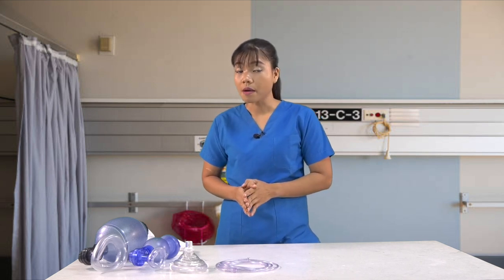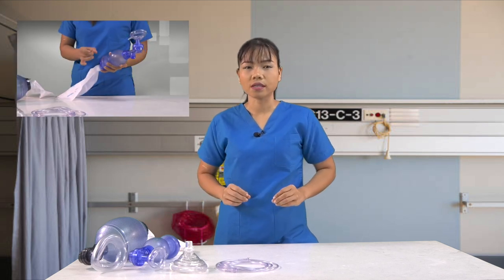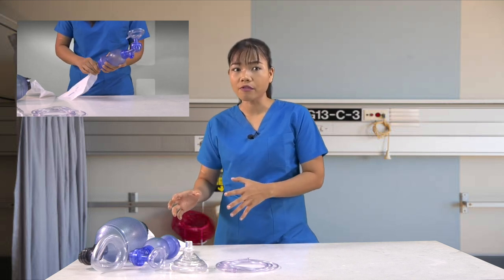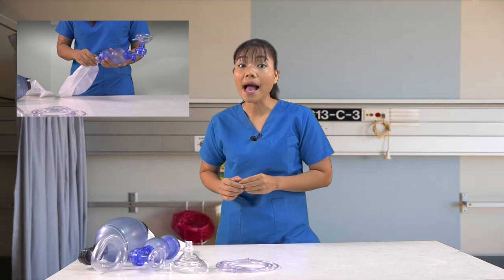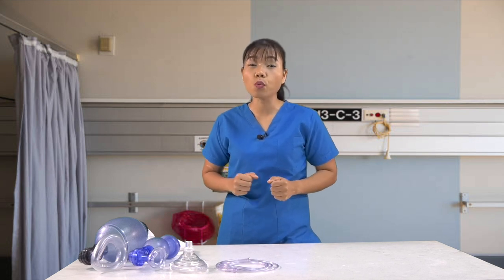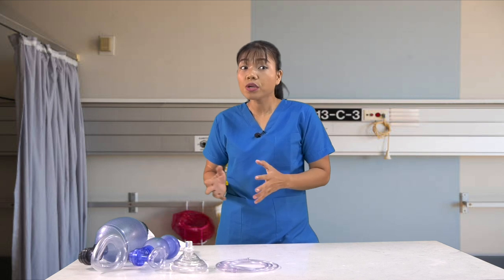Some aspects to be aware of concerning bag valve masks are the following. First, sometimes the oxygen reservoir will be attached right out of the bag from the manufacturer. Other times, you have to attach it yourself. Second, the reservoir is meant to be used with 100% pure oxygen, so when you deliver rescue breaths to the patient, they are getting a higher concentration of oxygen to compensate for any oxygen deprivation they may experience.